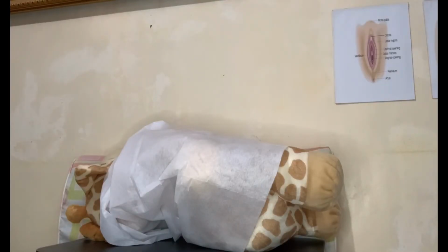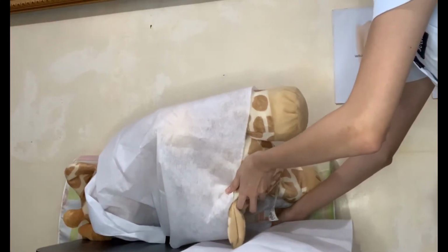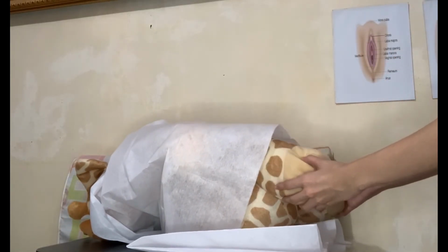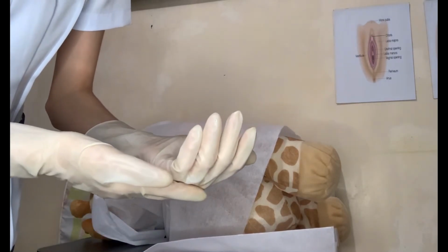So now we will open the catheterization kit and will place a waterproof drape under the buttocks of the client without contaminating the center of the drape with your hands. And once again, we will apply sterile gloves.